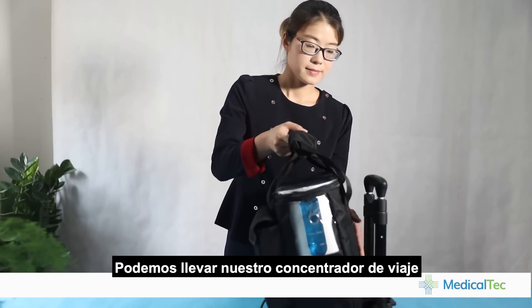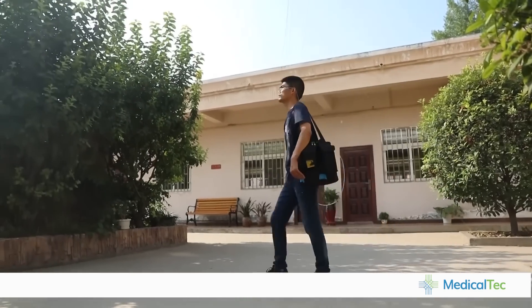Now you can carry the oxygen concentrator to travel.